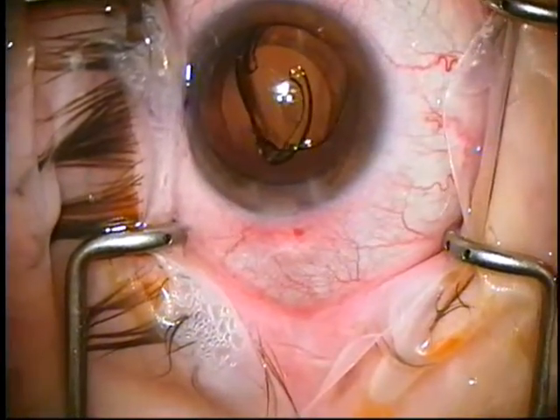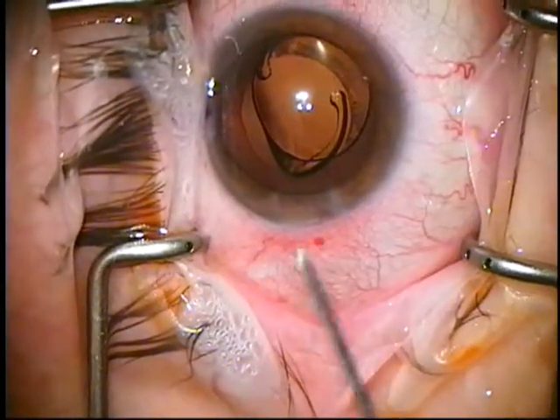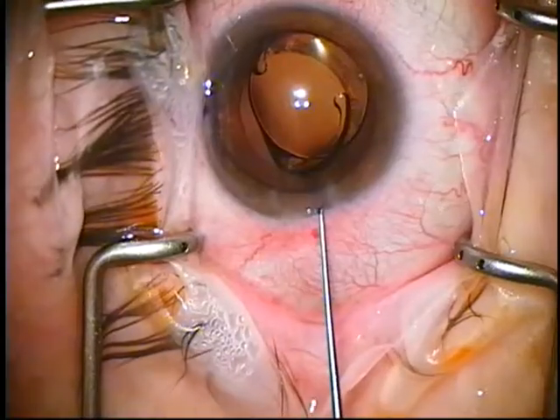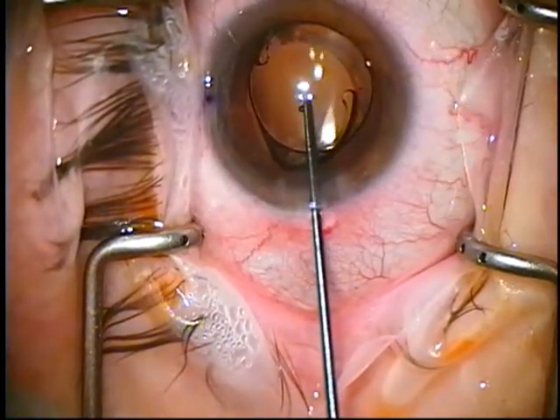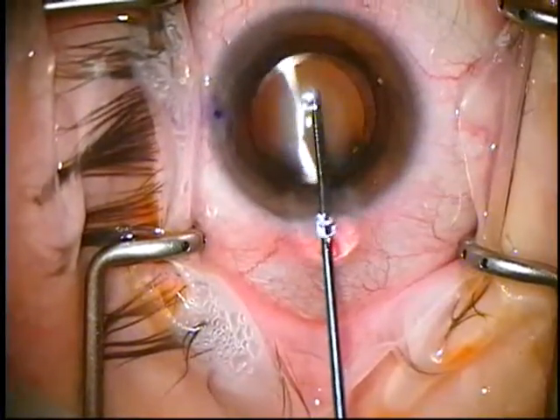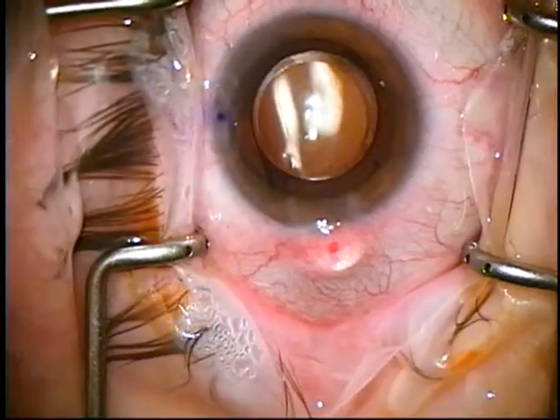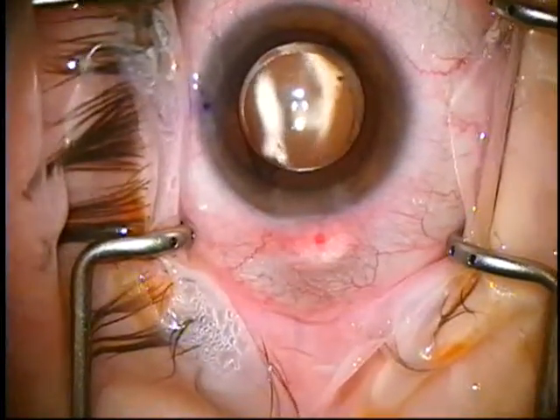You can do lots of ways of centering the lens. This is a Lester collar button. I come in and I push the whole lens down, then I pull it towards me. This way I don't have to touch the haptics, just the optic. You can see it's a nice 5.5 millimeter rhexis, well-centered.